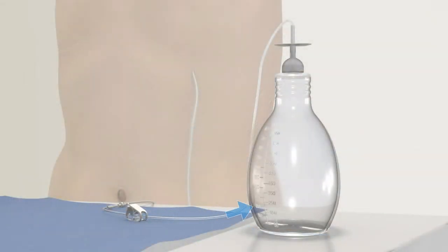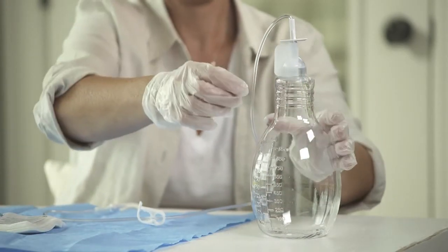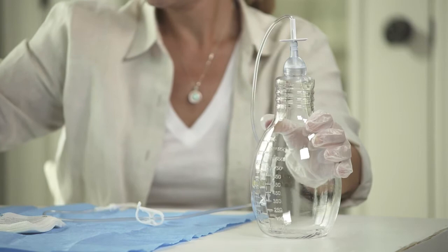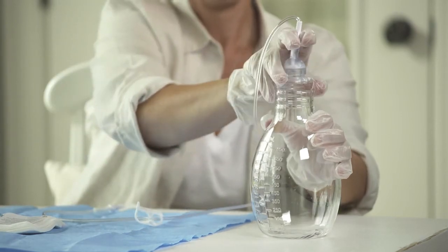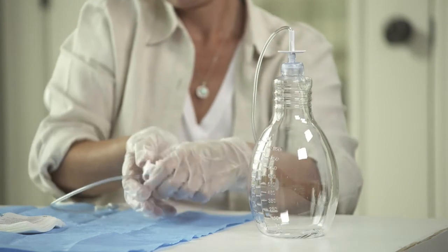PleurX drainage bottles use active vacuum technology that provides suction to automatically drain the fluid. The support clip on the drainage bottle maintains the foil vacuum seal until you're ready to break it. To open the seal, steady the bottle with one hand and remove the support clip with the other hand. Hold and push the white T plunger straight down to puncture the foil seal.